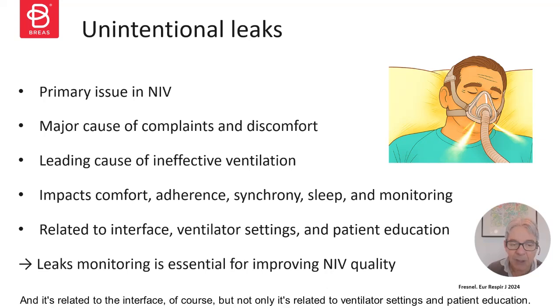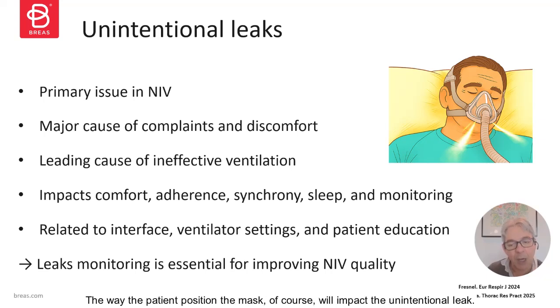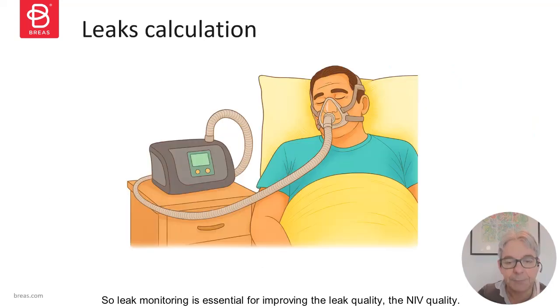It's related to the interface, of course, but not only. It's related to ventilator settings and patient education. The way the patient positions the mask will impact the unintentional leak. So leak monitoring is essential for improving the NIV quality.